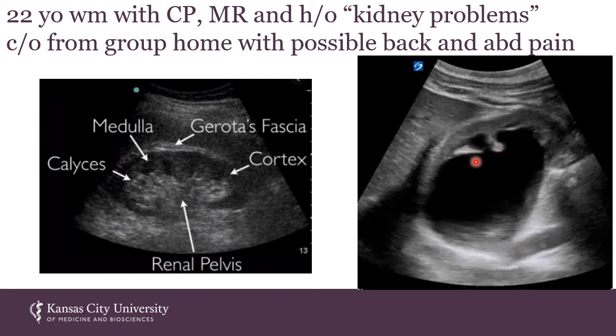He's got a widely dilated collecting system. This is his renal cortex up here. See how it's all kind of mashed out, and then there is a very dilated ureter. So he's got hydronephrosis. Now who knows the cause? Could it be a big stone, or does he have some sort of ureteral stricture or something weird going on? It's hard to say, but his pain is basically from renal colic. So that was a nice ability to just take a quick look at that.